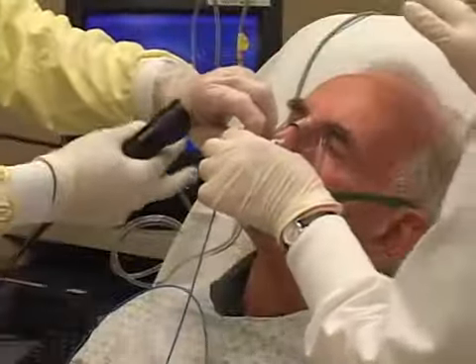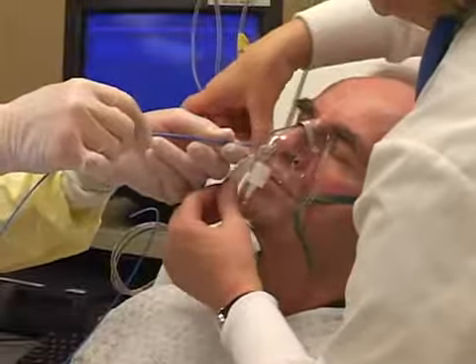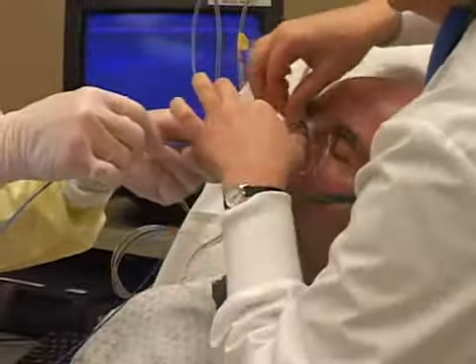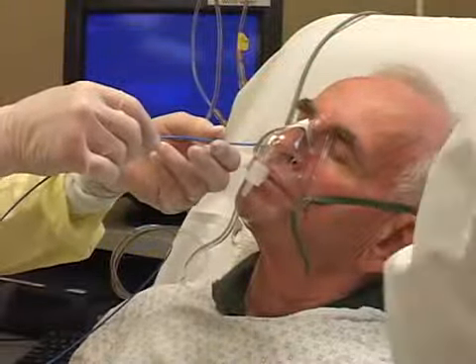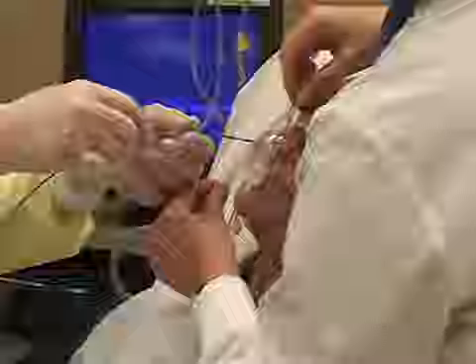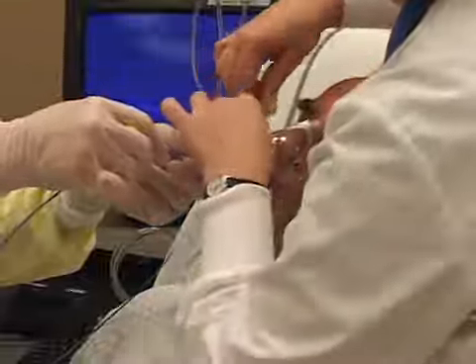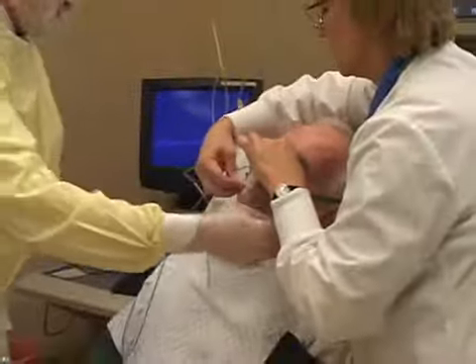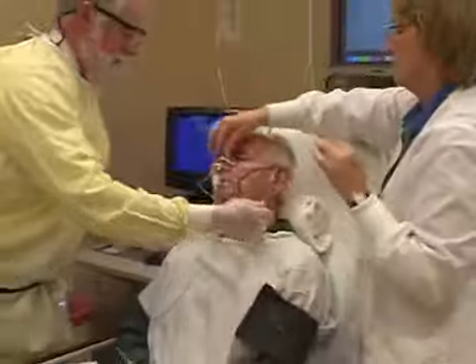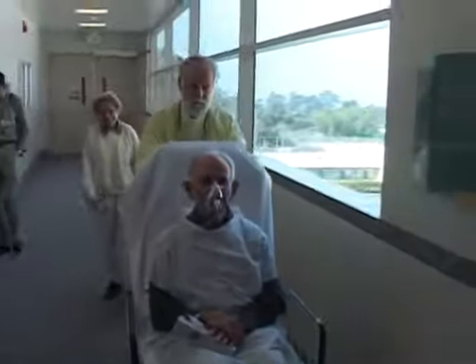The bronchoscope is once again removed with care so as not to dislodge the catheter, and the catheter is securely taped to the face mask. The patient is then transported to the Department of Radiation Oncology.